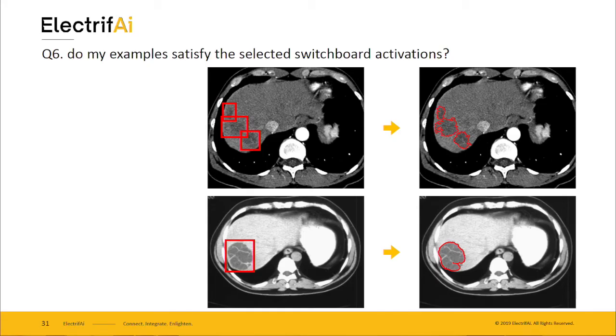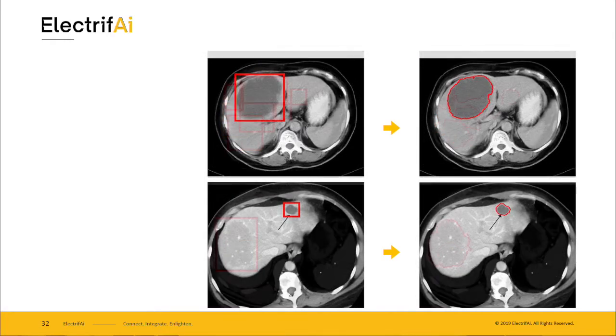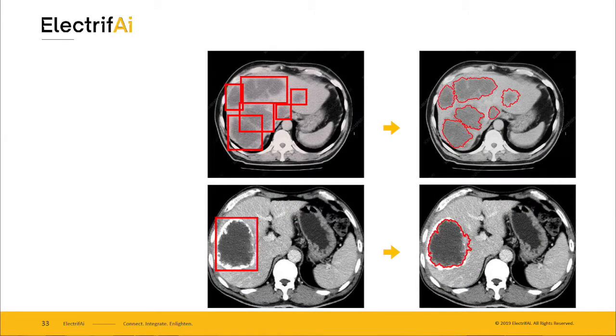And a very good question to ask once you do this is, how good is this segmentation representing my input? So we're not doctors. We didn't speak with doctors yet. This is just purely our own empirical evaluation, but we just started this 2 months ago. So here you do see a couple of examples that showcase where we believe tumors are. We just went over there, we just encircled them, and we got these results as automatic segmentations. This is a metastatic example, which is a little bit more complicated, and we got pretty good results, actually.